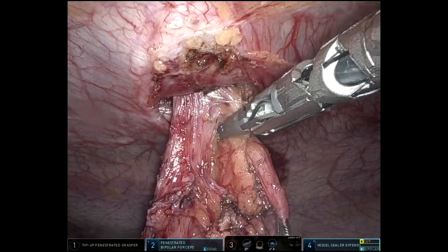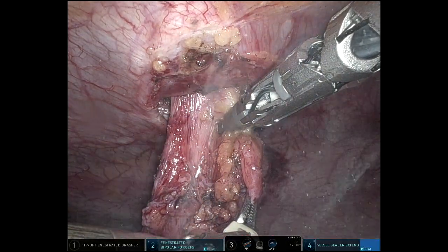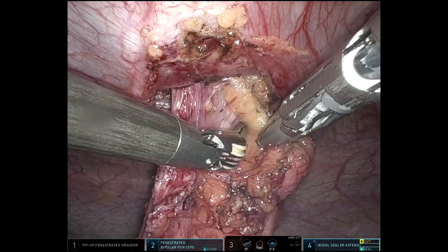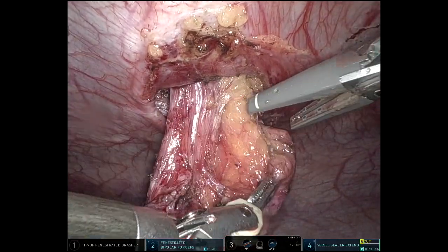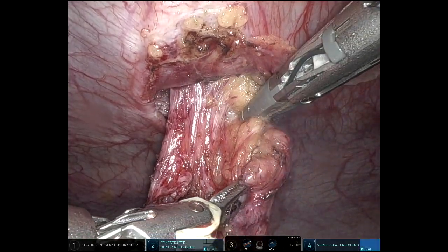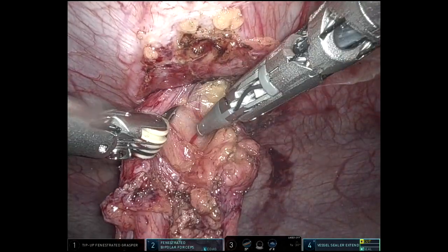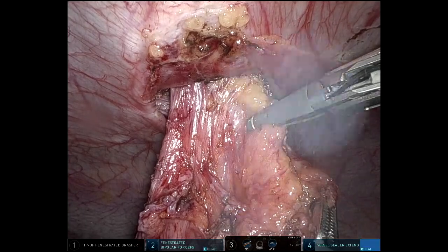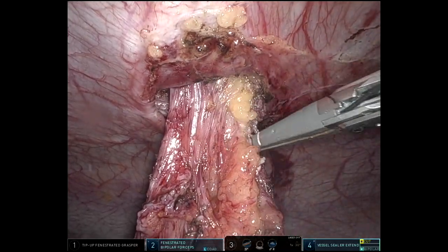I'm just going to clear off the colon, taking the mesentery completely until I just have colon. This will be where I'll staple across the colon — that'll be the proximal part of my anastomosis.